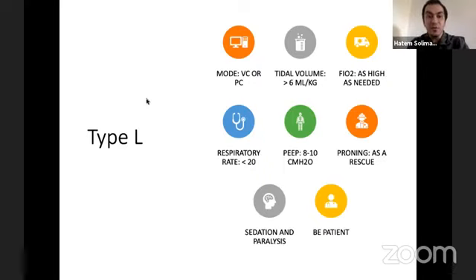So I often feel more comfortable to extubate my patients when I see a predominant A-lines pattern, the predominant pattern of normal aeration across the lungs. We don't expect the B-lines to disappear, but I'm talking about the predominant pattern across the lungs in different zones. So my key message here, be patient with these patients. Don't wake them up early and don't extubate them unless you are comfortable. Usually 10 to 14 days is the average. There's no solid cutoff or solid number. It is all your clinical judgment, but this is what we saw and our colleagues saw in other centers as well.